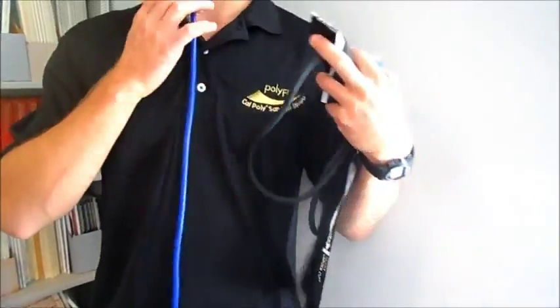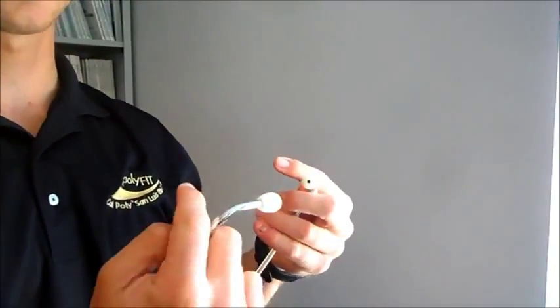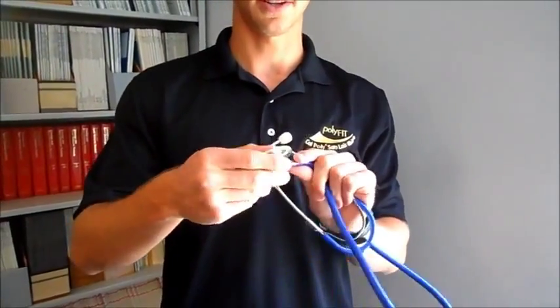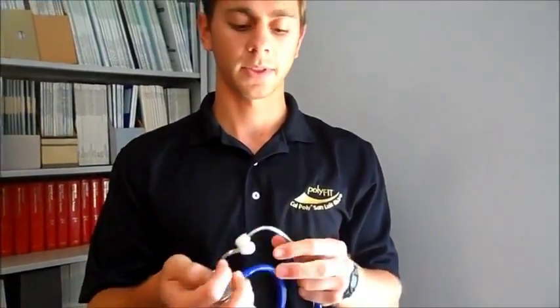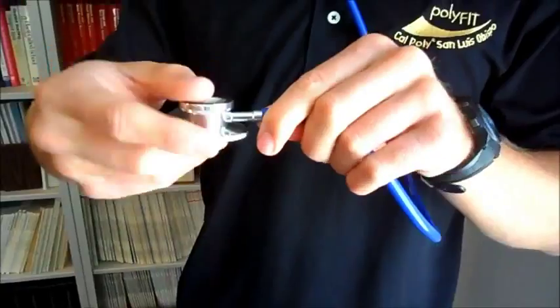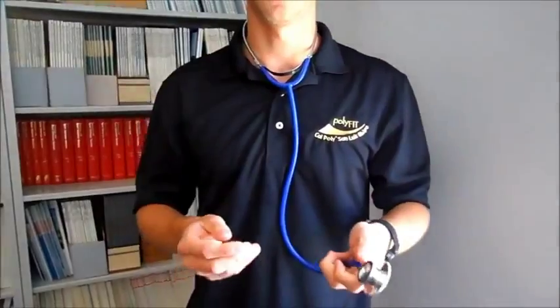You listen for pulses with the stethoscope. When you put it in your ears, make sure the prongs are facing forward, not backwards. Double-check that it's on by twisting it and tapping — you should be able to hear it. If your stethoscope is turned off, you might think the patient has no pulse when really it's just not working.